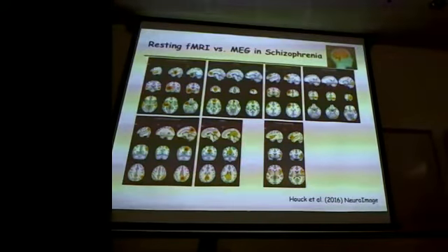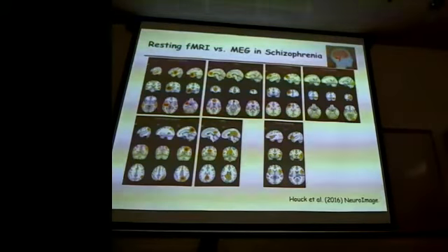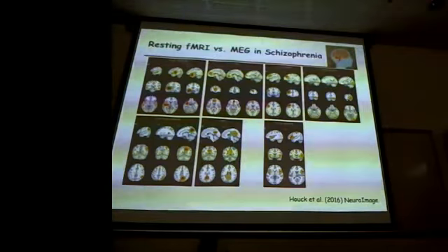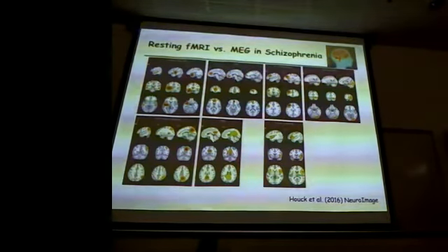But there are cases, and there's been a lot done. The primary use clinically for MEG is with epilepsy cases, so there's lots of data out there. There are cases where MEG can see an epileptic spike and EEG can't. And there are cases where EEG can see an epileptic spike and MEG can't. The optimal is to do MEG and EEG, so you get everything.